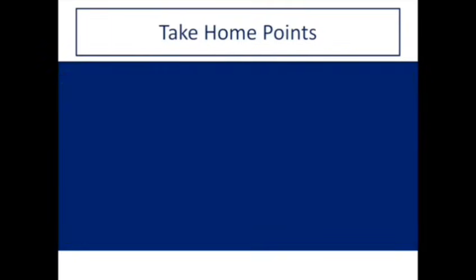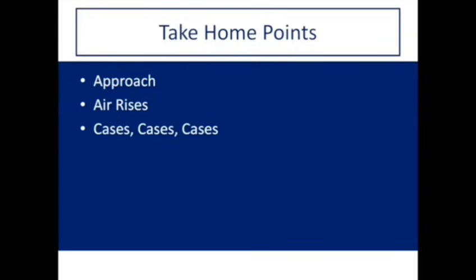Okay, that's it for this very short video on abdominal x-ray. Remember our simplified approach. Secondly, remember the basic concepts. Always remember to look at what view you're looking at, and remember that air rises. Lastly, the best way to get better at looking at abdominal x-rays is to look at as many cases as you possibly can.